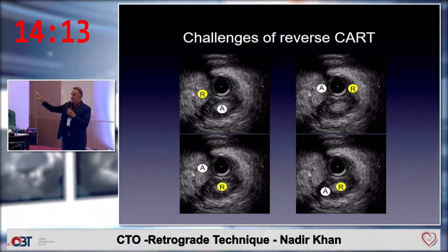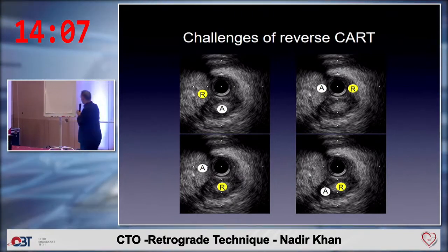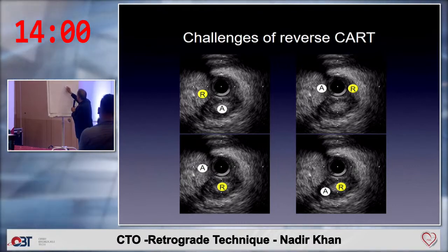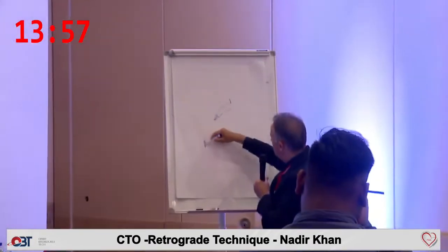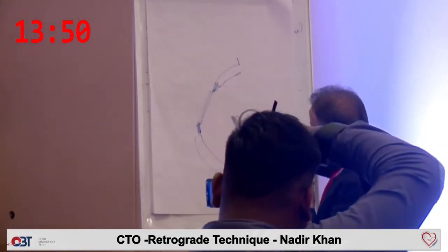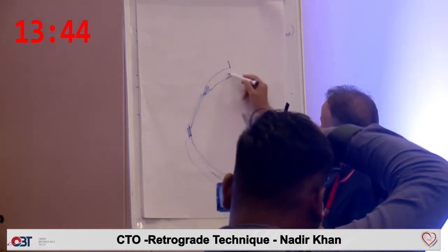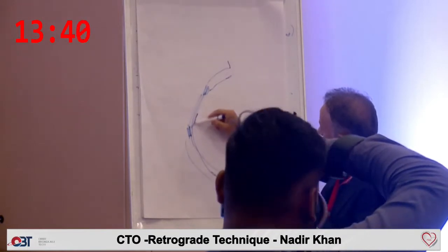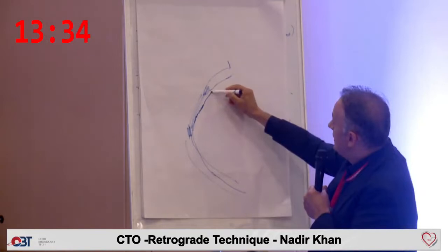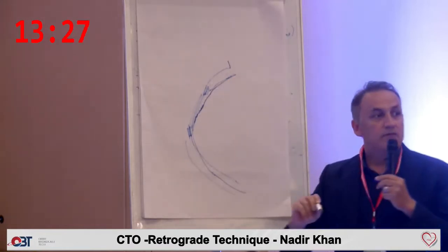Did you show some pictures regarding reverse CART at the beginning? No, not really how we do it. I'd like to draw here shortly. For example, this is the RCA. We have an occlusion here, and this is distal. In the first scenario our wire can cross it easily. In the second, it stays stuck here maybe. Or even if it goes subintimal up to the ostium, that's another scenario. So we have to cross into the lumen, right? How do we do it in that case?